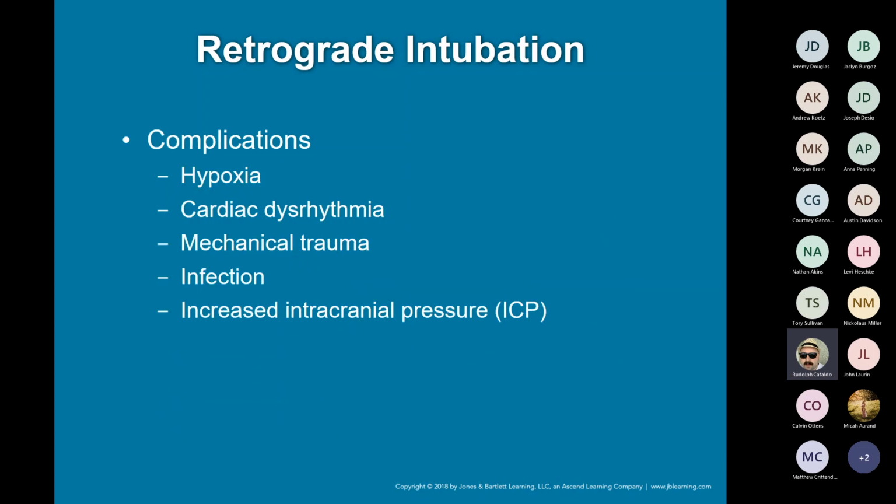Now, it does take some time. It obviously can cause hypoxia in our patients because it's going to take a lot more time than us performing intubation. I told you guys in the field, I shoot for 30 seconds or less, and that's what I try to train you guys to the level of. Because at that point, we're minimizing oxygen loss, we're minimizing any potential complications. There's also some complications with how quickly we do it, if we're doing it correctly. That's why I teach you guys in the beginning, slow is fast, be efficient before you're quick about something. Because if you don't understand how to do it and you're just trying to ram and jam, then it's going to end up not turning out well for you.